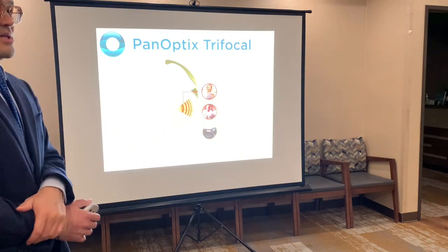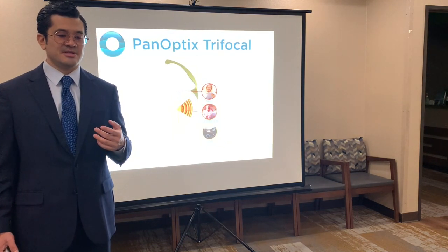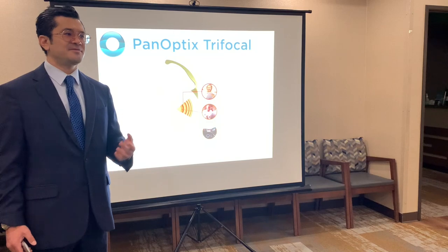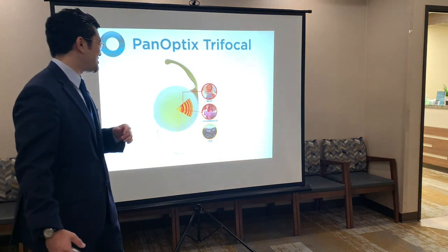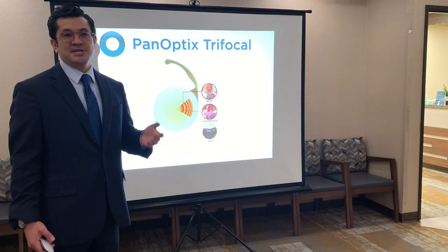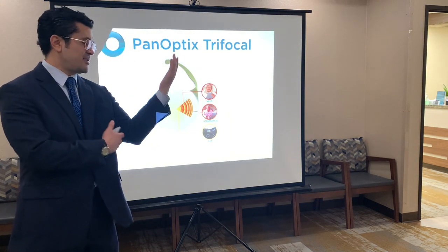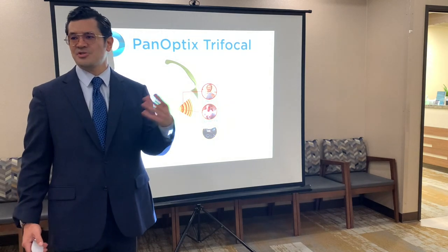So the next few pictures I'm going to show you are helpful, because as you talk to patients about lenses and implant technology, it's good to give real life situations, because what does near mean? What does intermediate mean? It's a little technical. So I'm going to show you some photos of real life examples, because how do you explain to someone what near means? Well, I just kind of show bent arm, but real life examples are probably more helpful. What does this mean to them when they're shopping at the grocery store, for instance?